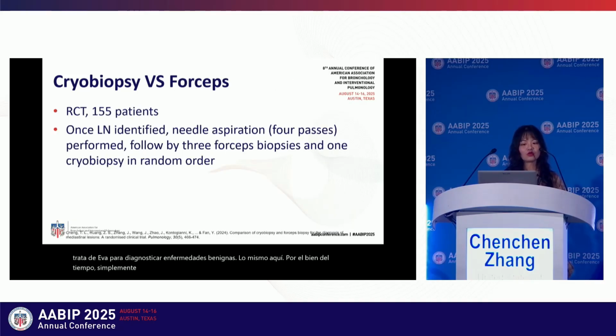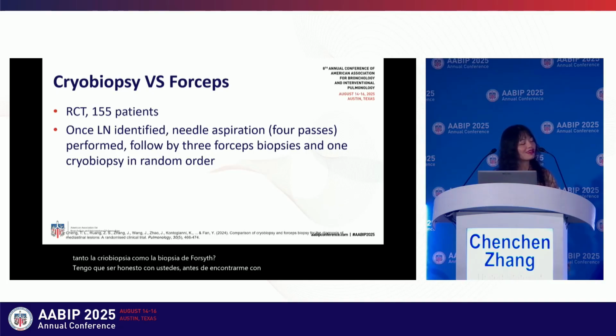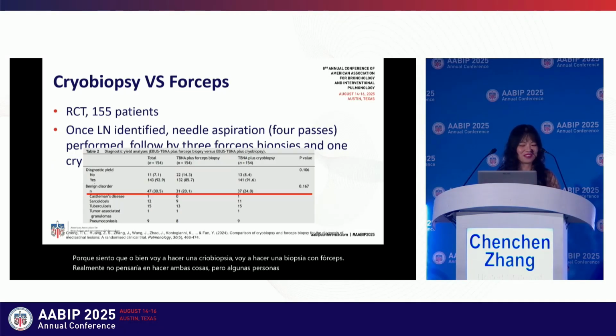And then people may ask, should I do both cryobiopsy and forceps biopsy? I have to be honest with you guys, before I encountered this paper, I never really thought about that, because I feel like either I'm just going to do cryobiopsy or I'm going to do forceps biopsy. I wouldn't really think about doing both. But some smart people thought about comparing them, which is really interesting.